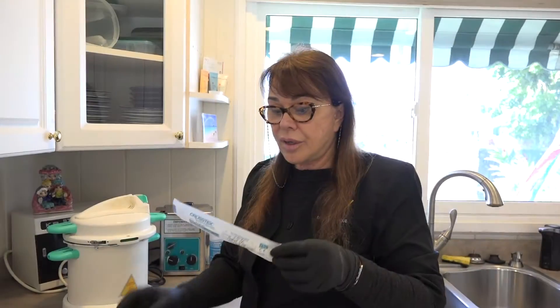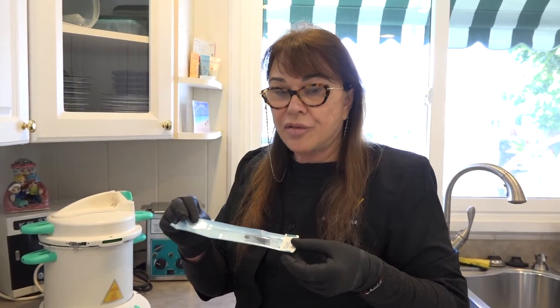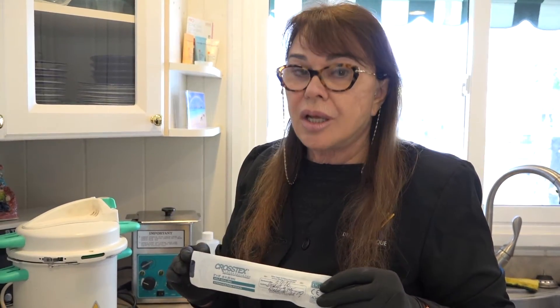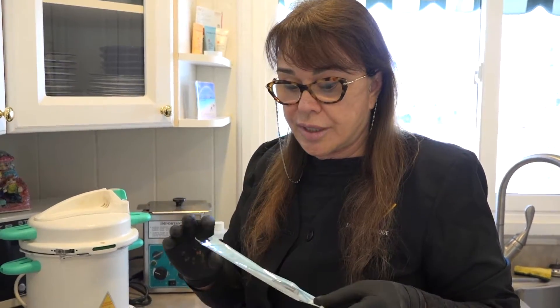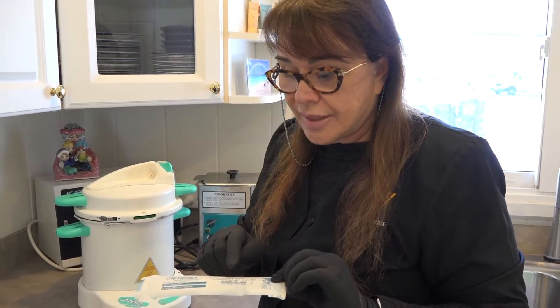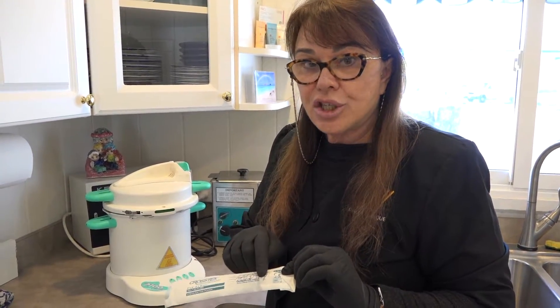Here is your pouch with your pigment to be sterilized. You can make as many of these as you wish, but you just need to seal the pouch with the name, the product number, the date, and the batch number.